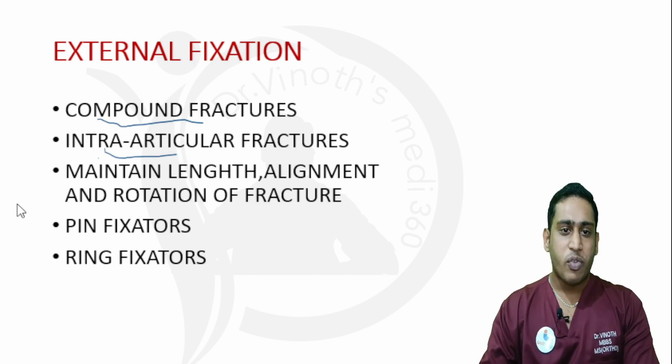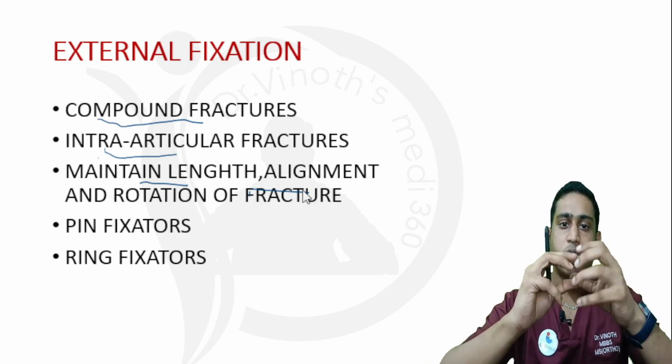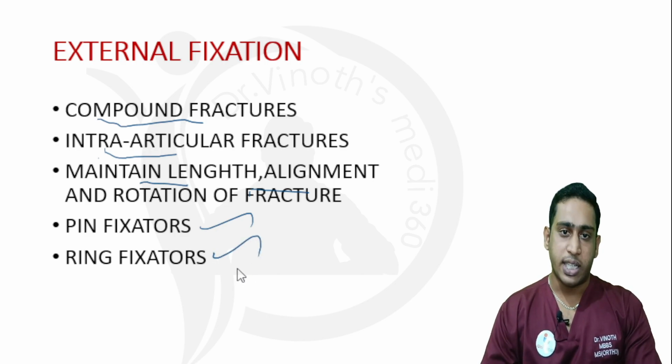What is the purpose of external fixator? They are applied to maintain the length, the bone fracture alignment, and then rotation. The rotation is also more important, so for the rotation of the fracture. So there are two types of external fixators. One is pin fixators. The second one is ring fixators.